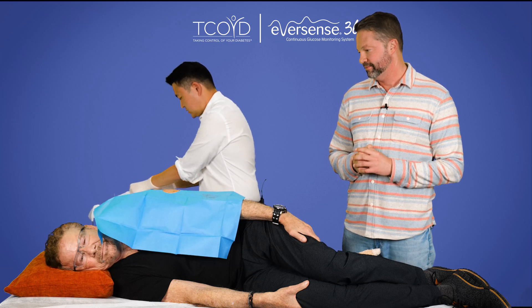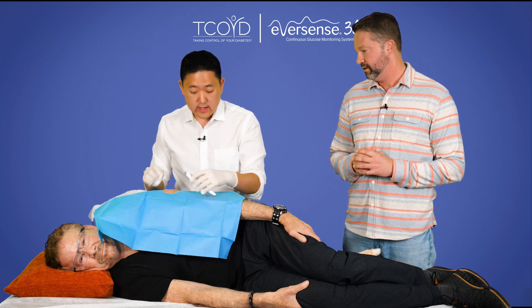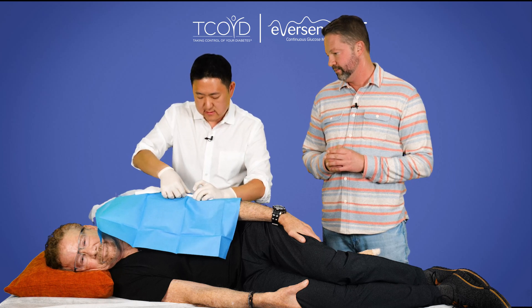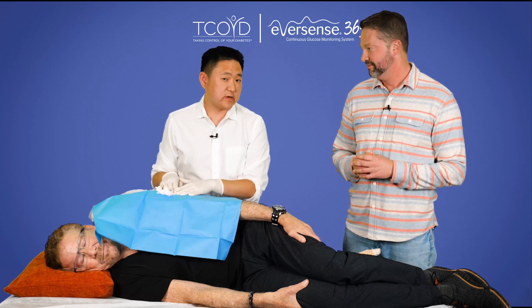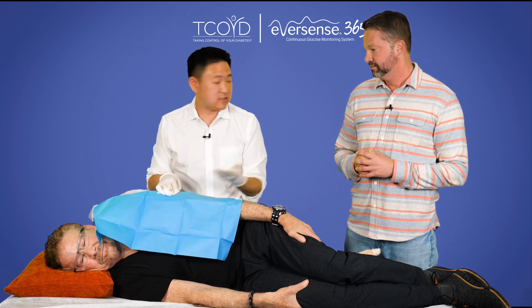And then we're going to use the insertion tool, right here. And that has the sensor in it? Correct. So the sensor is located in the tip. To go back into that same cavity. Retract it, and then the sensor's in. All right, Steve. Wow, got a new sensor. And then after that, we just hold pressure for a few moments for the bleeding to stop, and then we'll put on the SteriStrips and the Tegaderm to close the insertion.